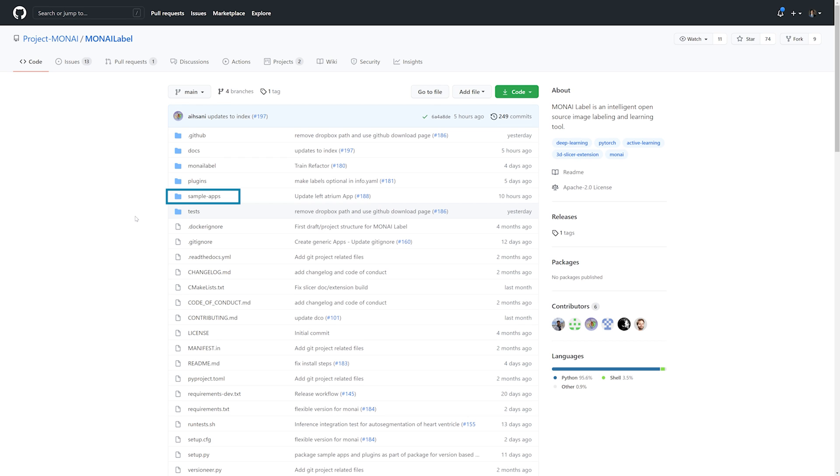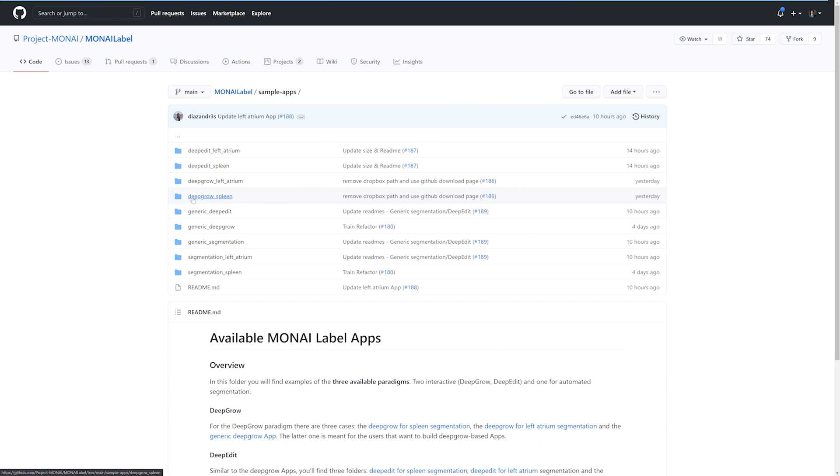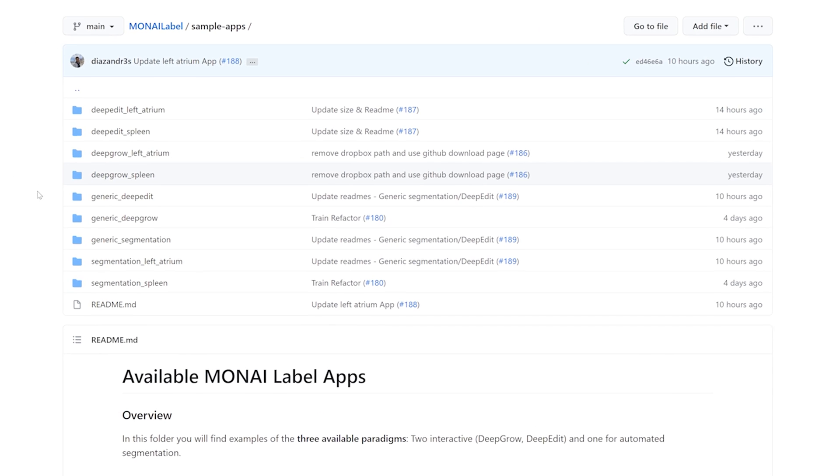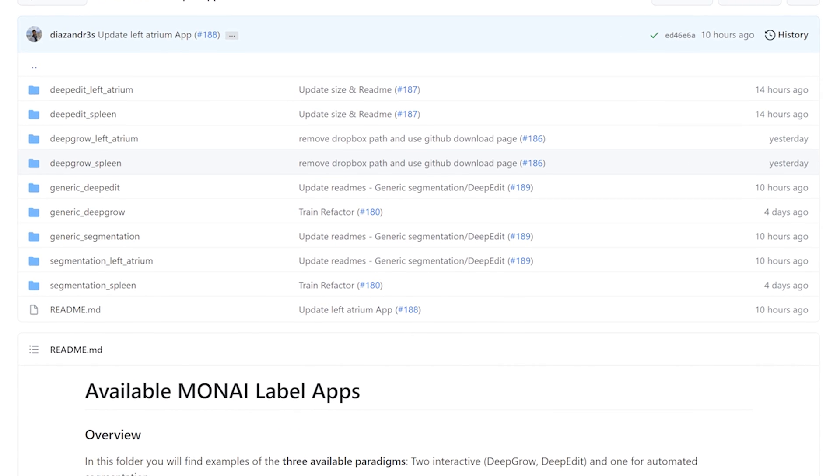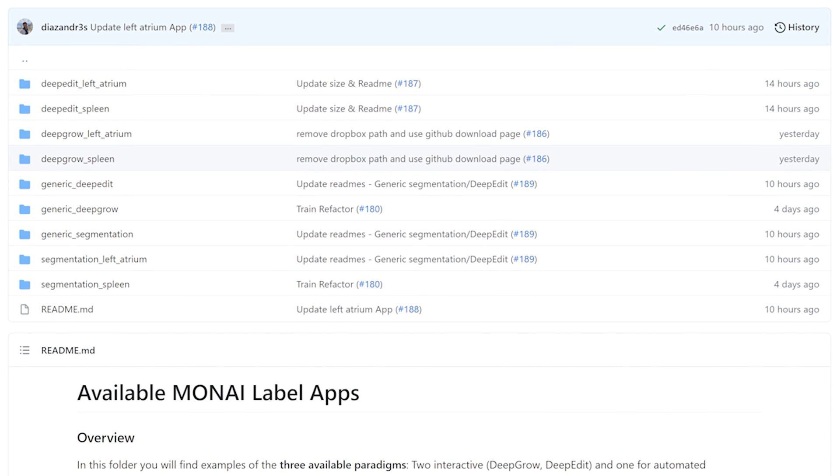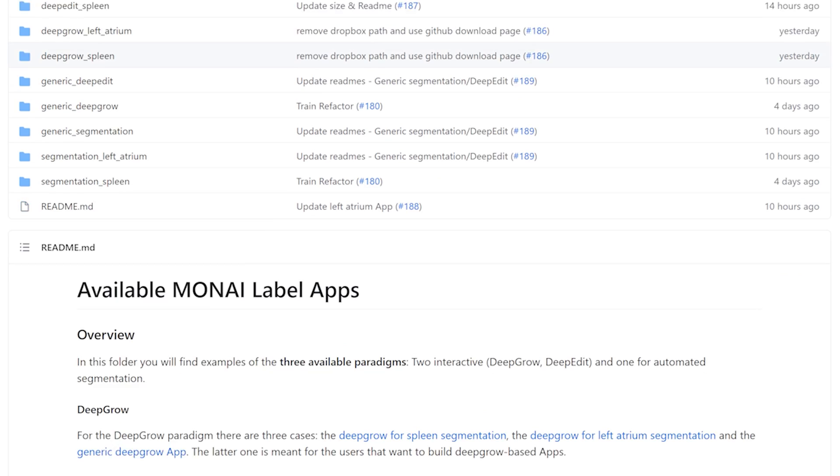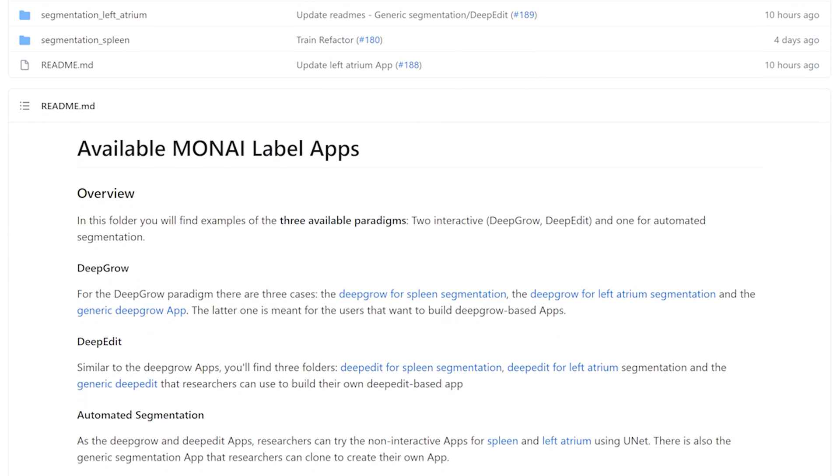Developers and researchers can also build their own MoniLabel application. To help get you started with this, we've included three template applications which developers may use as a guide to help them get started quickly. We also welcome contributions of MoniLabel applications back to our GitHub.